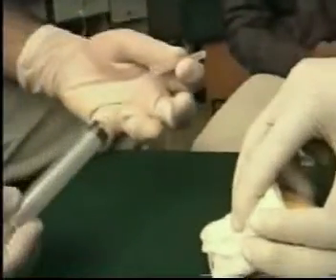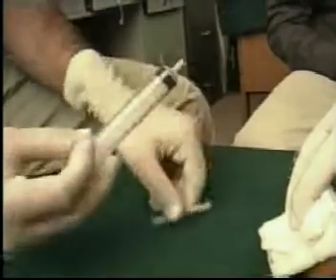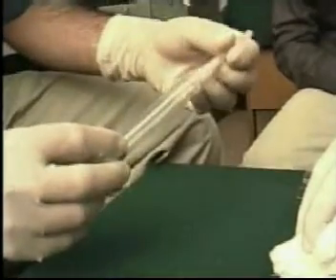Apply the cap of the syringe, then remove the needle, suck air into the barrel, and reapply the needle.